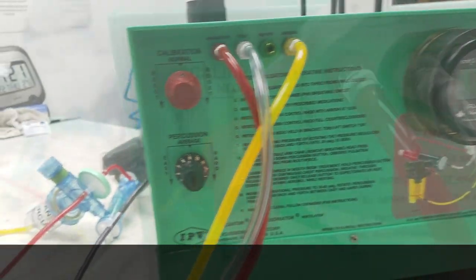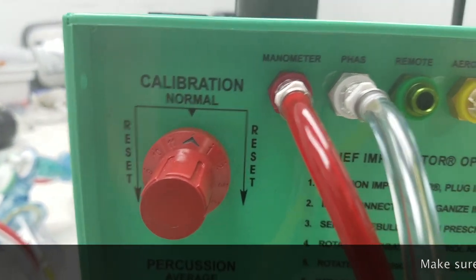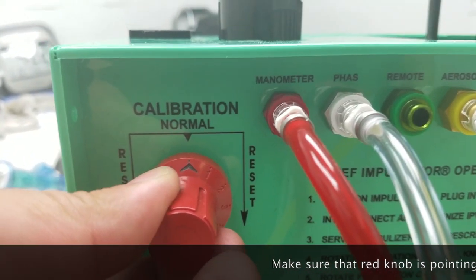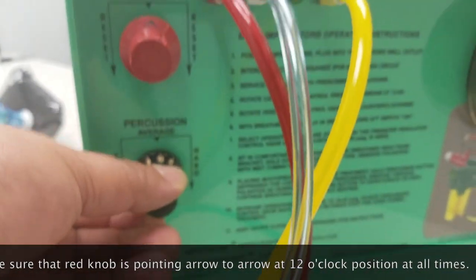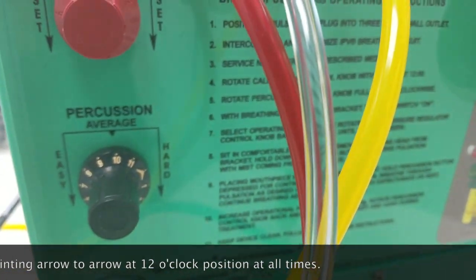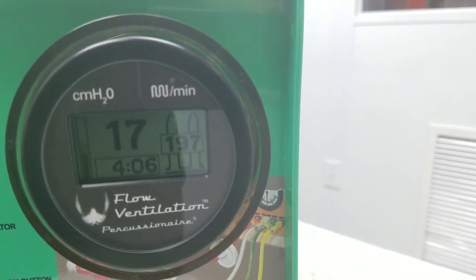At the top left you're going to have a red knob. This is your calibration knob. An arrow is going to be facing up — you want to make sure it is facing at the 12 o'clock position so that it is calibrated per the manufacturer's request when it leaves the warehouse. That's how they send it out. And then you're going to set the percussion — I'm putting it at the 12 o'clock position as well.